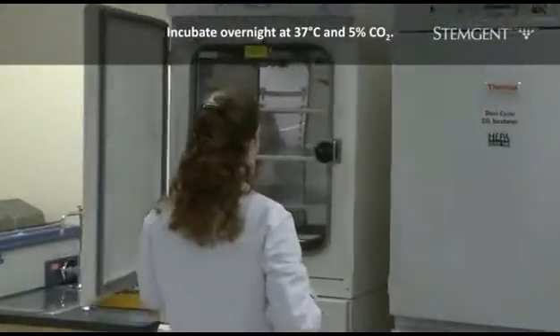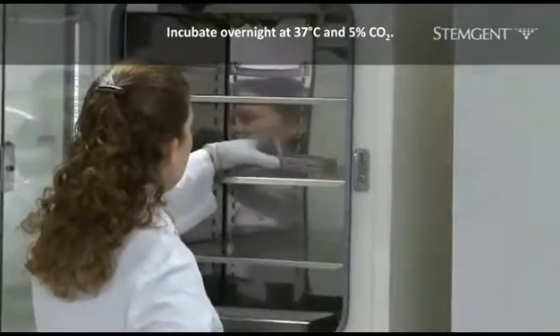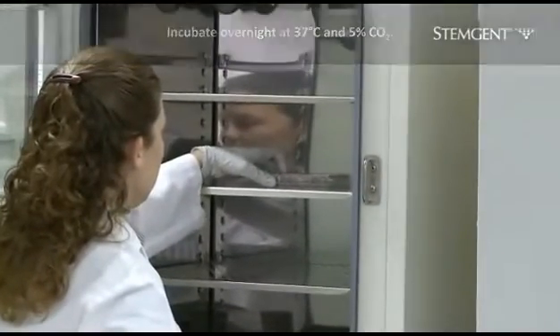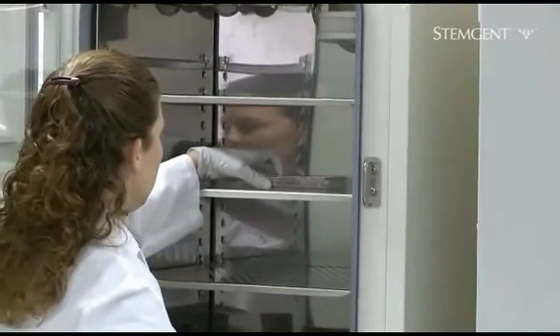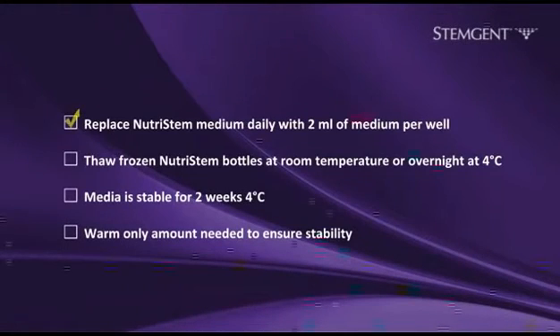Incubate the cells overnight at 37 degrees Celsius and 5% CO2 to allow the cells to attach. Remember to change your medium daily with 2 milliliters of fresh NutriStem medium until the HES cell colonies are big enough to passage again, about 5 days. When preparing your NutriStem medium, thaw the medium at room temperature or overnight at 4 degrees Celsius before use.